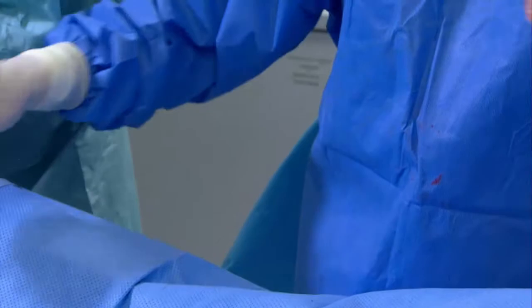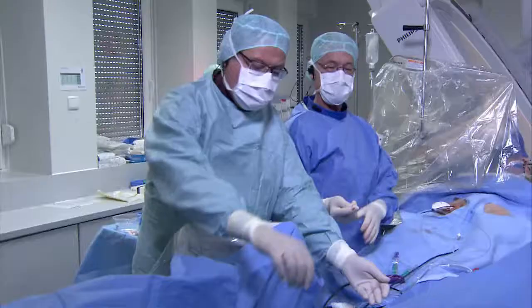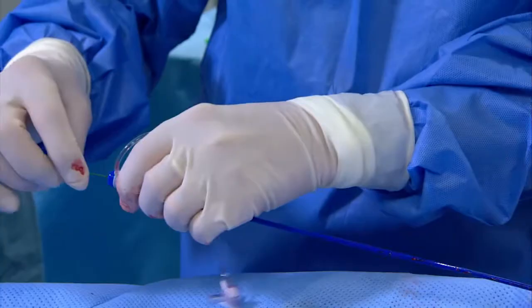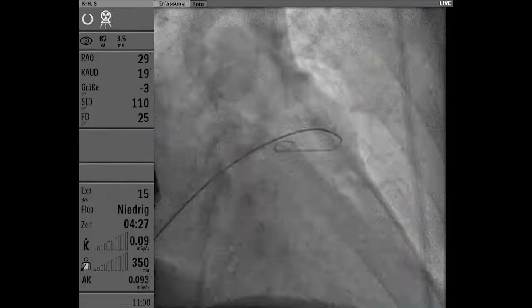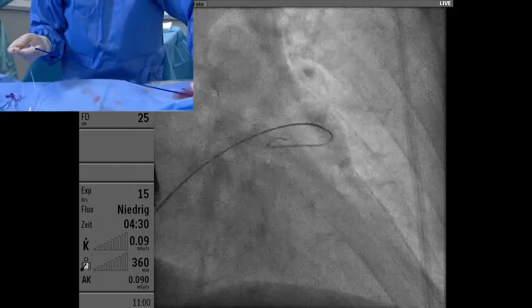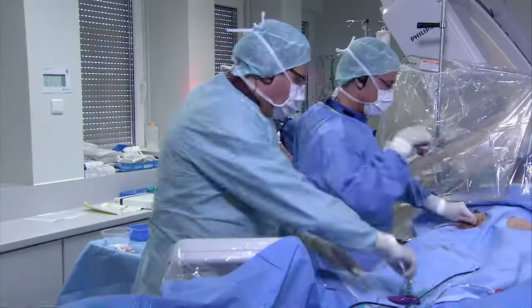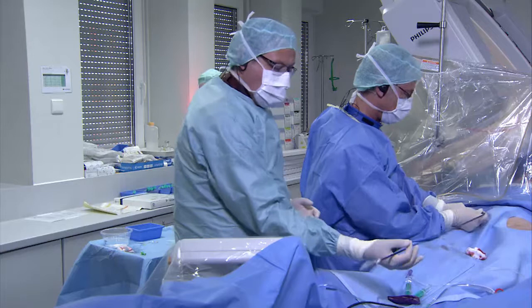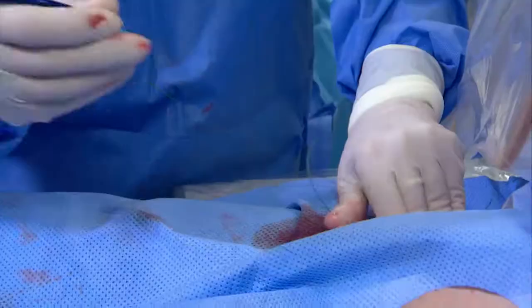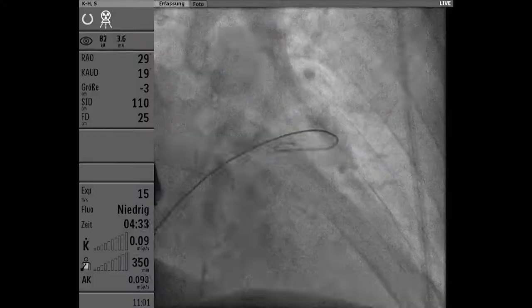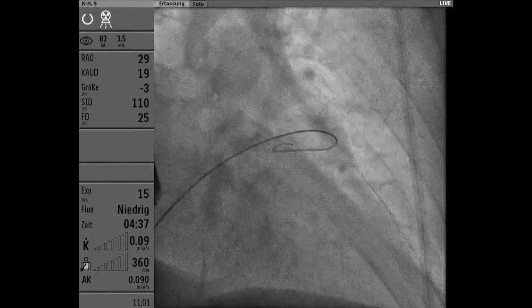Changing the routine from exchanging over the LAA with the wire in there to the pulmonary vein dropped pericardial effusion in early experience from 10% to 2%. Teaching others is much easier when doing the exchange in the left upper pulmonary vein. Using a multipurpose catheter through the transseptal sheath can help engage the left pulmonary vein when there is straight access to the LAA.